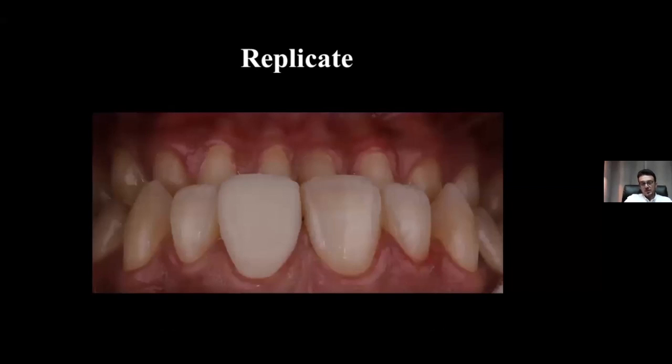Okay, we do a try-in inside the oral cavity. Till this point, everything is common, and then you can take this restoration outside of the oral cavity. You can use your color map or the acquired pictures to try to mimic the color shapes. But if you have the chairside system, CEREC system, and of course you have a porcelain furnace beside you, I see there is no reason that you dismiss the patient and then start to color the restoration and then give another appointment.